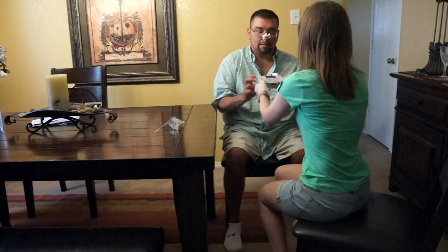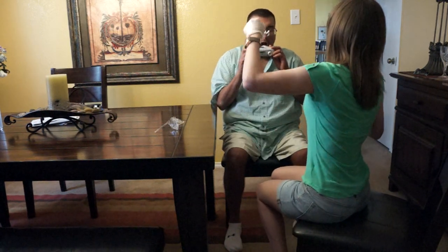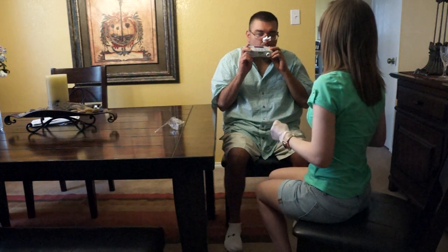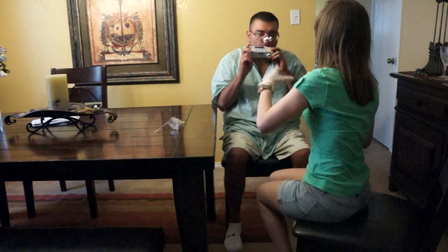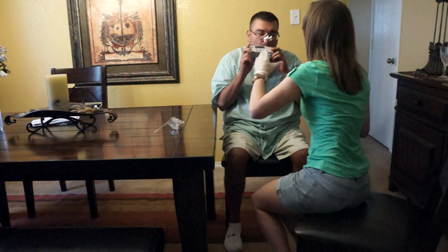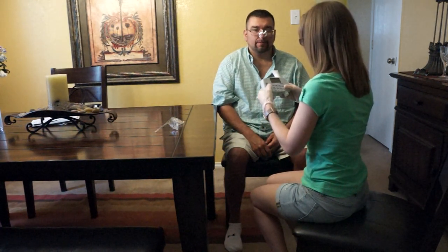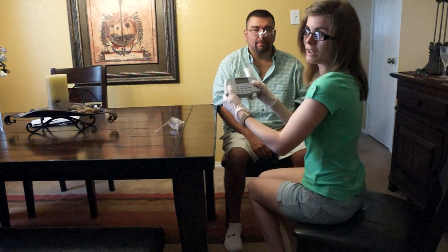Okay, big deep breath in. Big deep breath in. Go all the way to the top. Put your mouth on it. Blast out hard and fast. Go. Keep going. Good. Big deep breath in. Good.